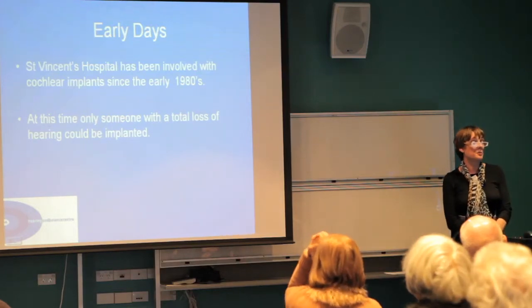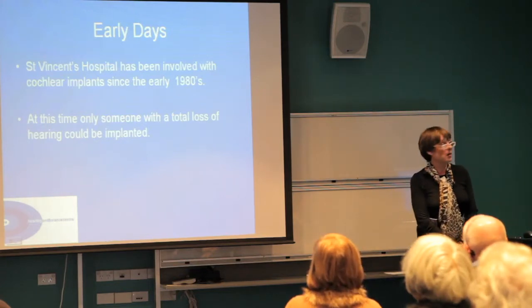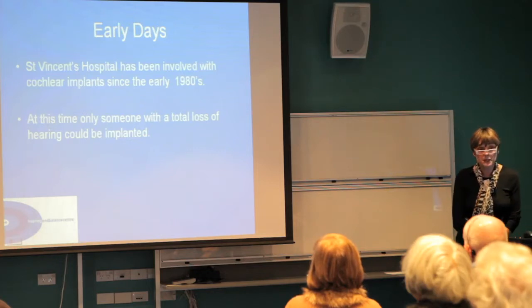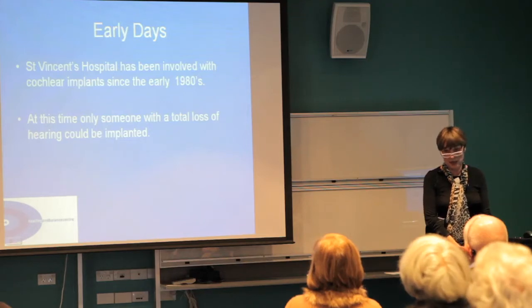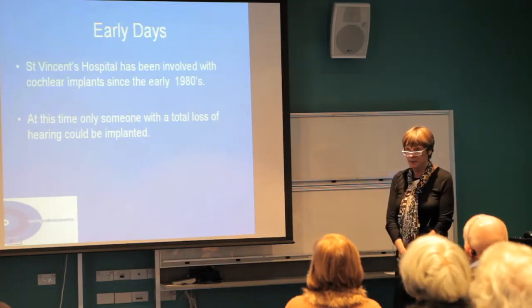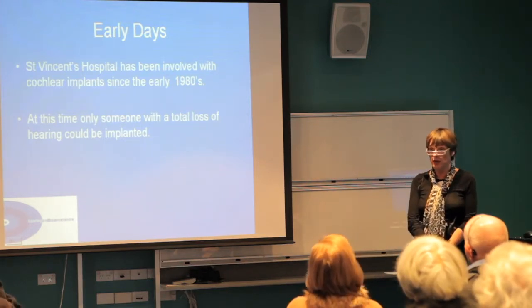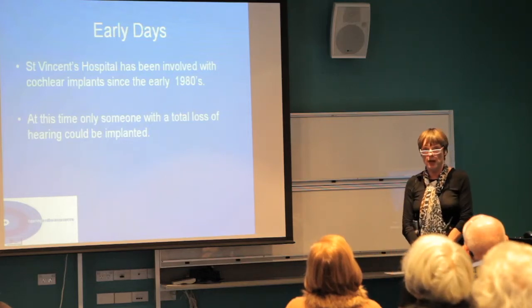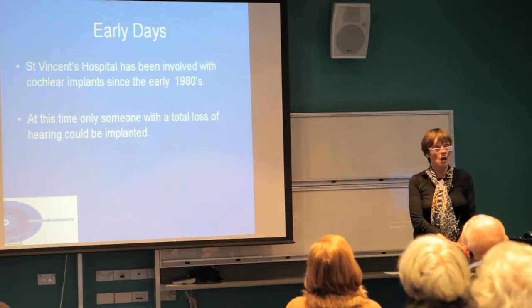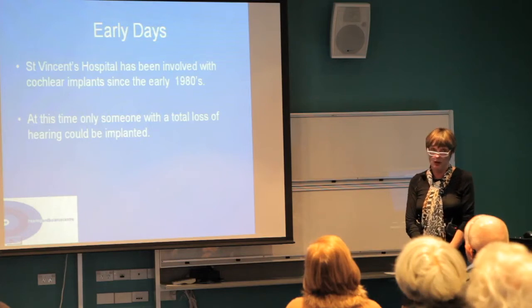So, St Vincent's Hospital has been involved with cochlear implants since the 1980s. So it's now over 30 years. At this time, in the beginning, only someone with a total loss of hearing could be implanted. So at that time I had patients, people that, for instance, would have difficulty hearing a plane taking off beside them. So we're talking about people who were completely deaf. And in the very beginning, we only had a single-channel cochlear implant.